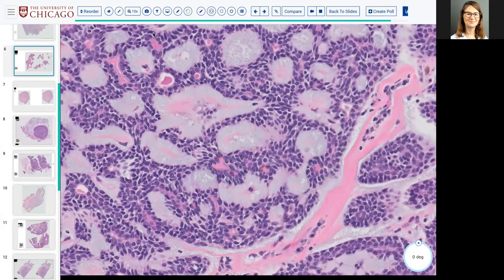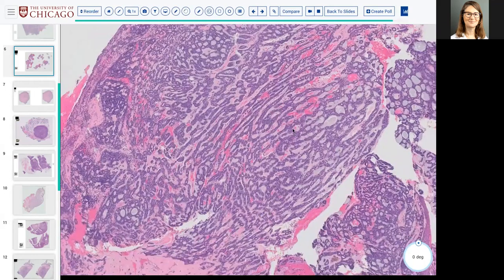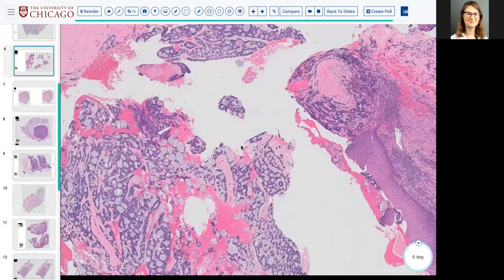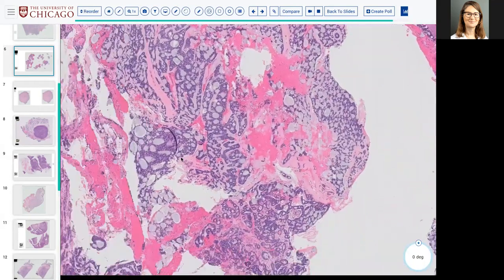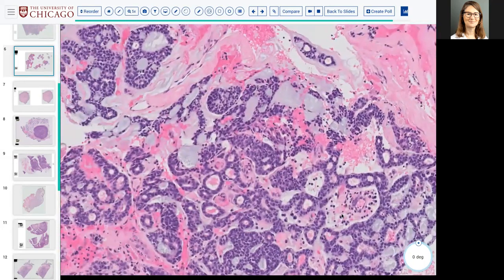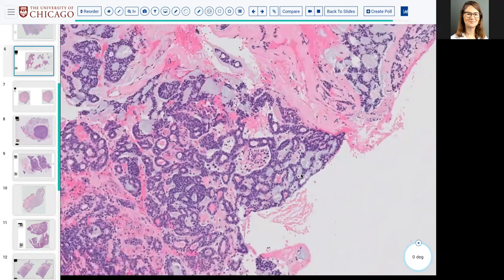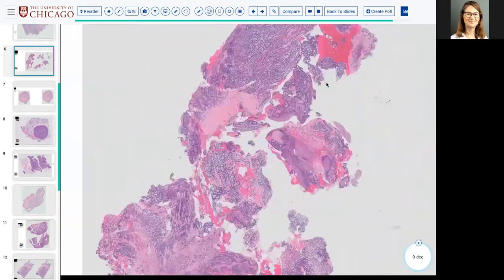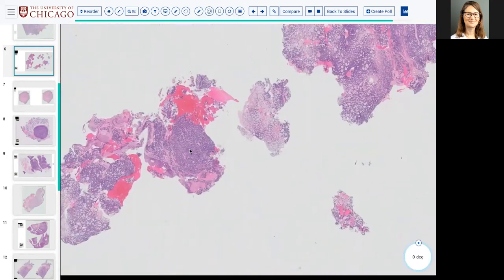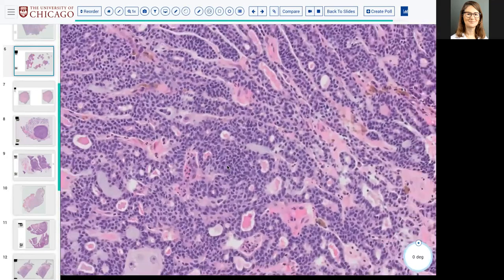Adenoid cystic, when it's obvious, is probably one of the easier ones to diagnose. The problem is when the features don't all line up correctly. But I've provided you with a pretty clear example of adenoid cystic, in terms of the combined tubular and cribriform architecture that truly is back to back. We don't really see much solid growth here, but whenever you start to see solid growth, that would be an indicator, maybe here's a little bit, of potentially more aggressive behavior.